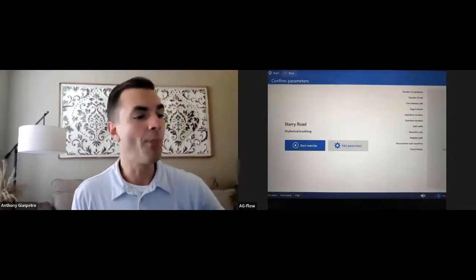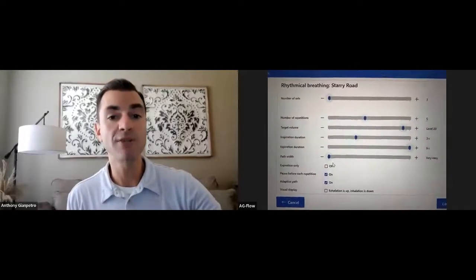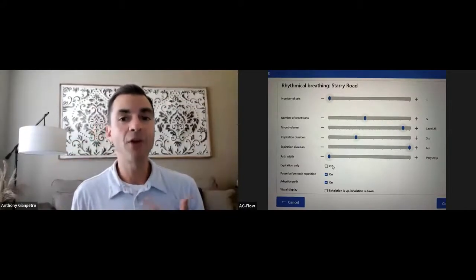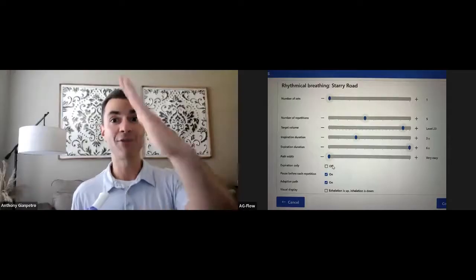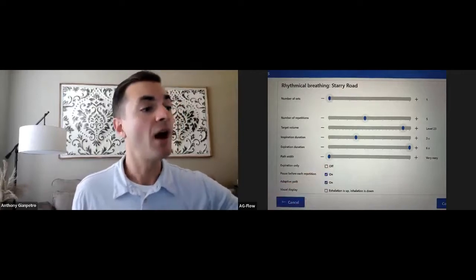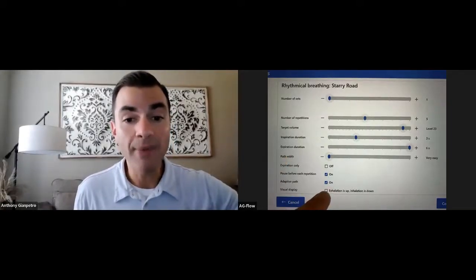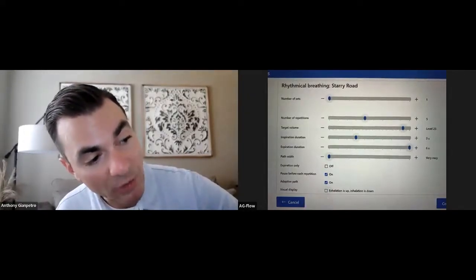Sorry about that. I'm going to go back to edit parameters because now maybe some of this stuff will make a little bit more sense. For instance, as I was exhaling out, you'll notice that the avatar was going down as I breathe out. Well, not everybody likes that. I have found there are a number of patients that want the opposite. They want when they inhale for the avatar to go down and exhale for the avatar to go up, or vice versa. So you have the option of changing that on the very bottom here: exhalation is up and inhalation is down. If somebody's complaining at you, just hit that and it'll change it around.